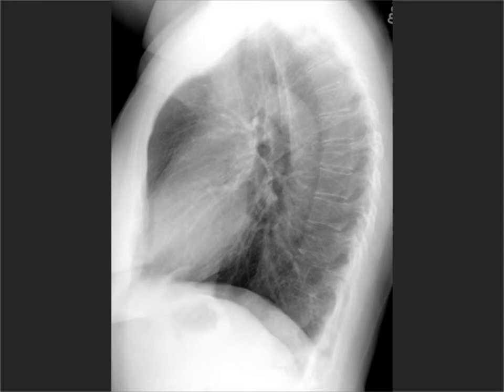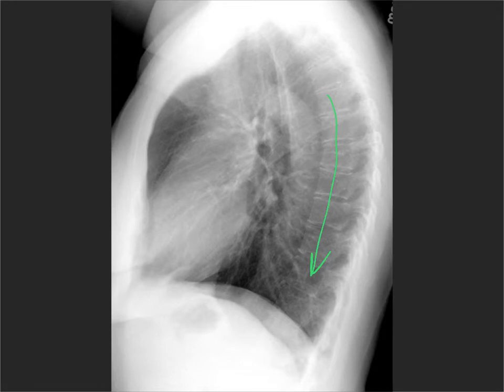The spine is back here, and don't forget the spine should get more lucent as you go lower down — it should not get more opaque until you hit the first hemidiaphragm. If it becomes more opaque before that, that's going to be a spine sign.